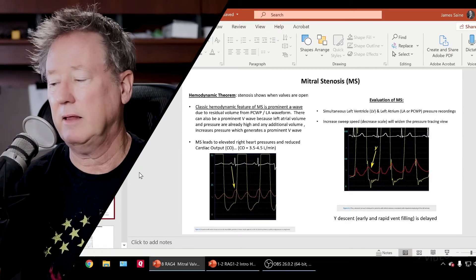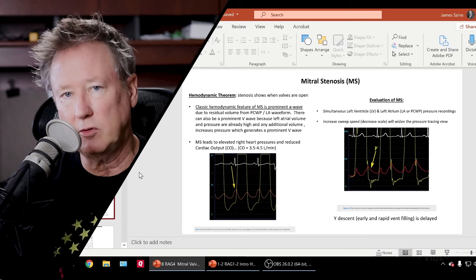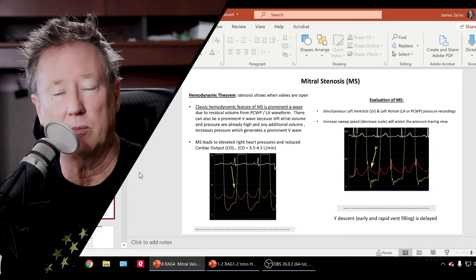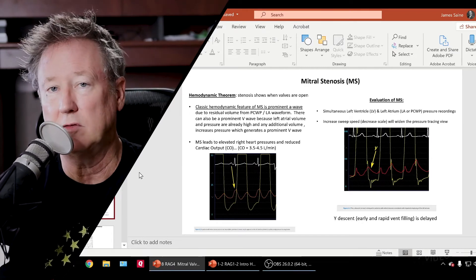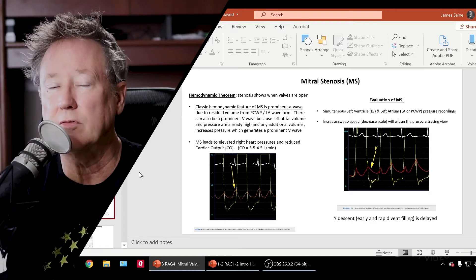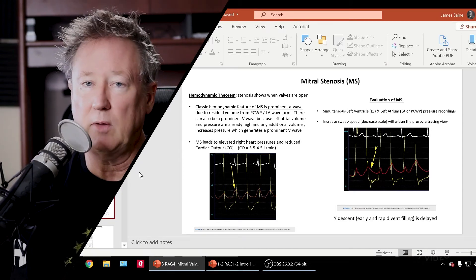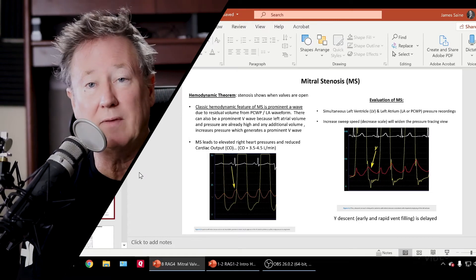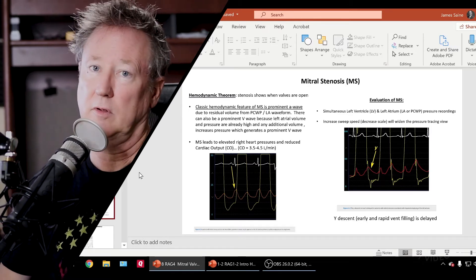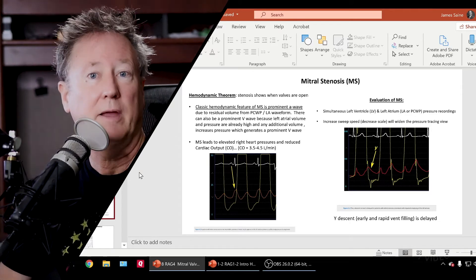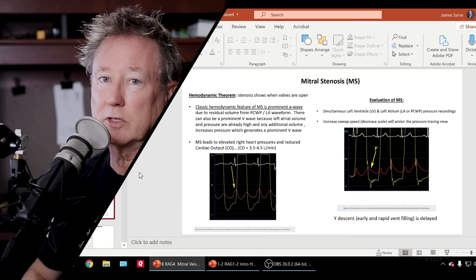Often in the cath lab you're looking at the wedge in relationship to the left ventricular pressure to evaluate the presence of mitral stenosis and mitral regurg. Generally speaking, a large A wave suggests mitral stenosis and a large V wave suggests mitral regurg — but there are no absolutes. You can have a large A wave without mitral stenosis, and a large V wave without mitral regurg. There are other things that cause a large A wave or a large V wave, but those are the typical associations.